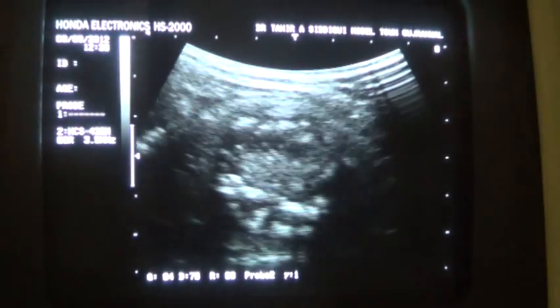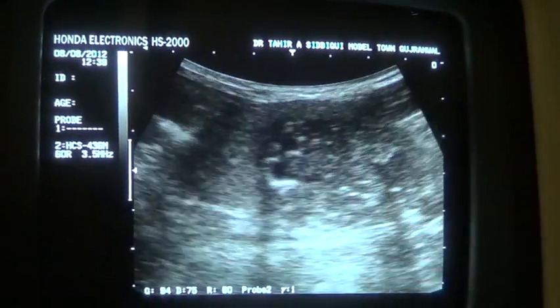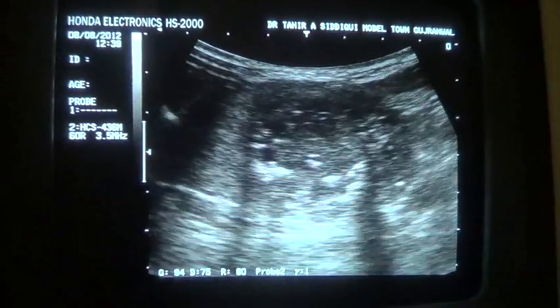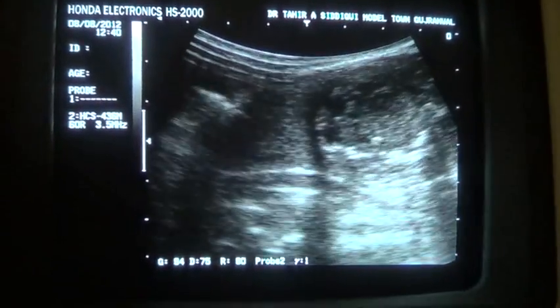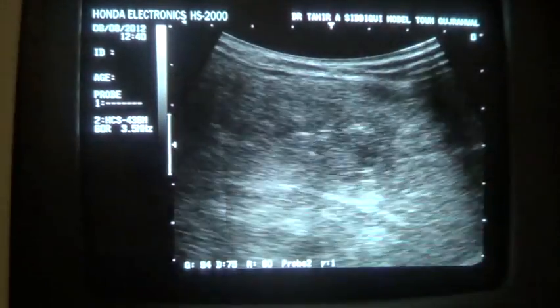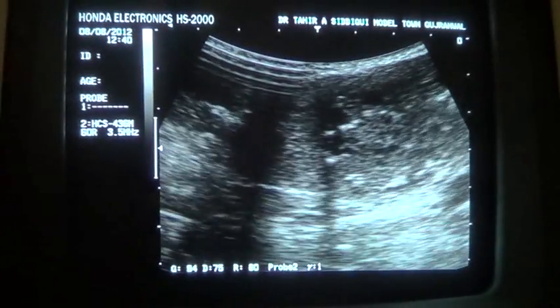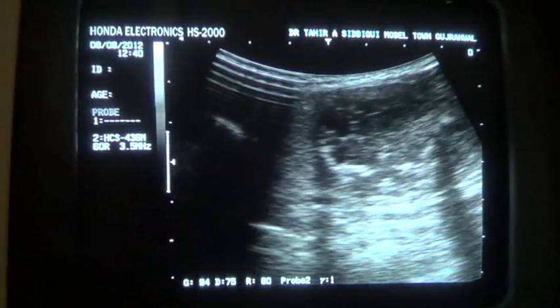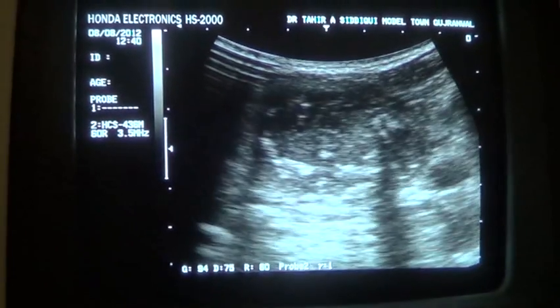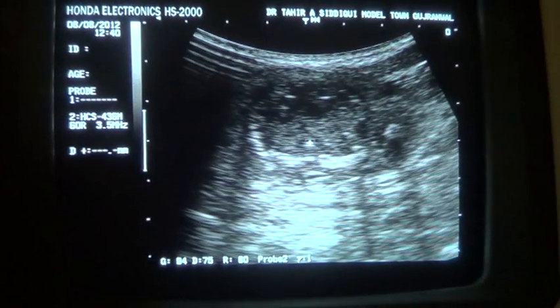Now, see that? Compromising upon the landmarks, if I try to get the thyroid in longitudinal section, then see how many calcifications there are. Almost an eggshell rim is present around this mass.